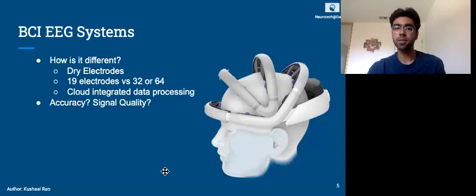And there's also limits to how accurate the data is that you're gathering, but the trade-off is expense and convenience. So these devices are cheaper and they're faster and they're easier to maintain. So that's the trade-off that we face right now between industry and academic settings.